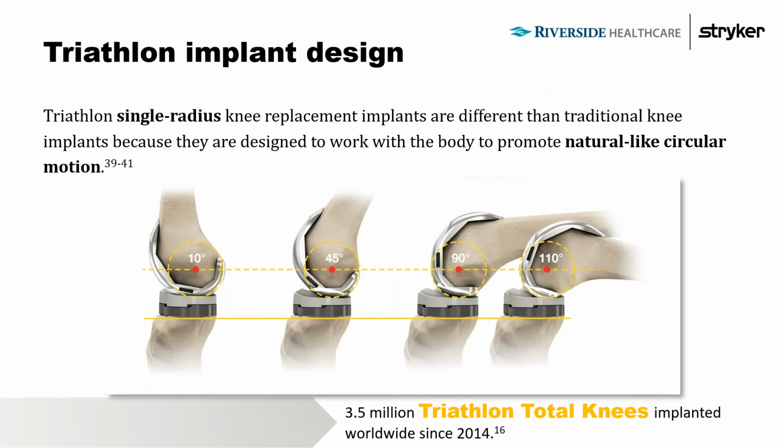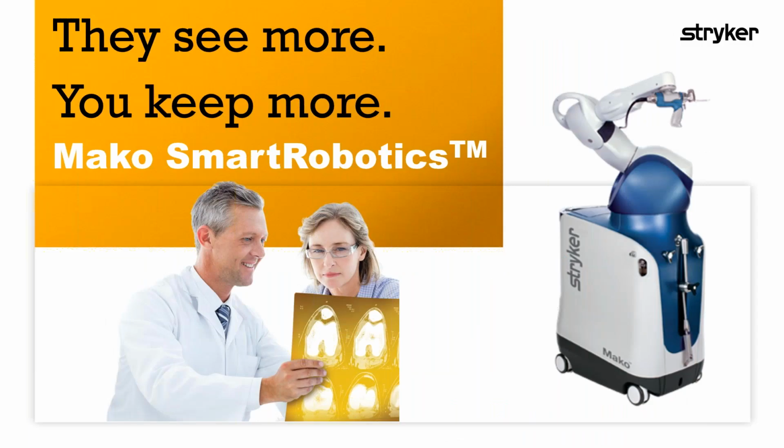And this is just talking to us about design. There are multiple manufacturers for knee design and we don't really support one over the other, but in terms of robotics, when we use a robot, it is specific to that implant. So multiple companies make multiple robots. The robot that we have here at Riverside is called the Mako. And so with the Mako, you have to use the Mako's design knee. And that's what this is showing us.